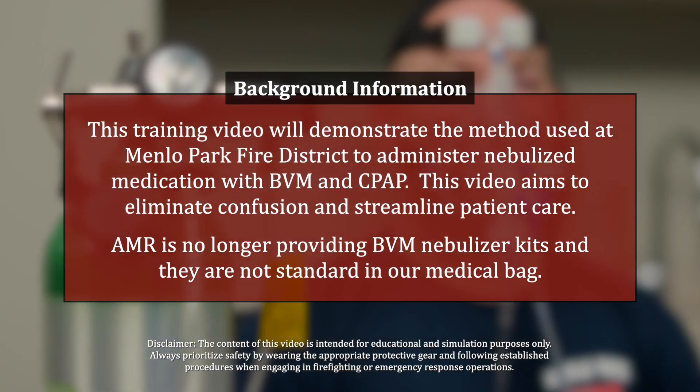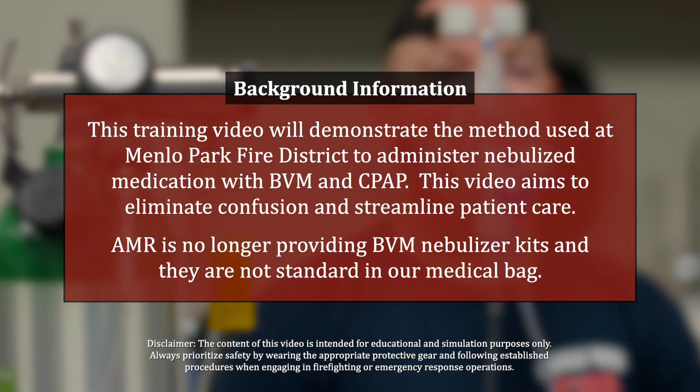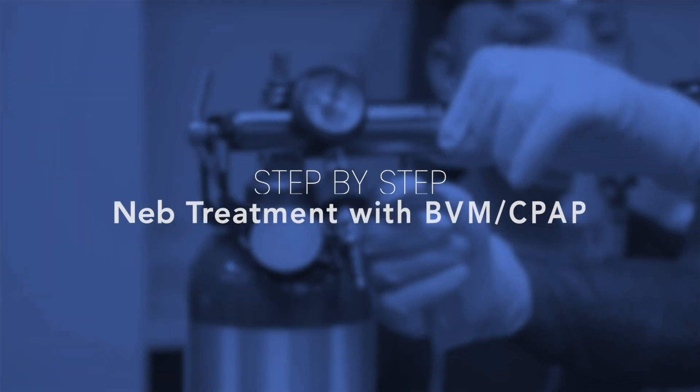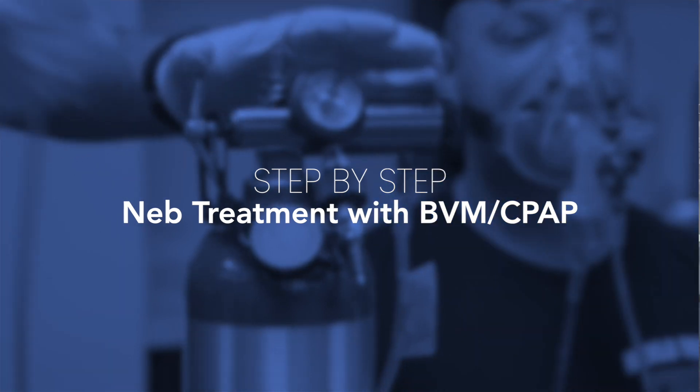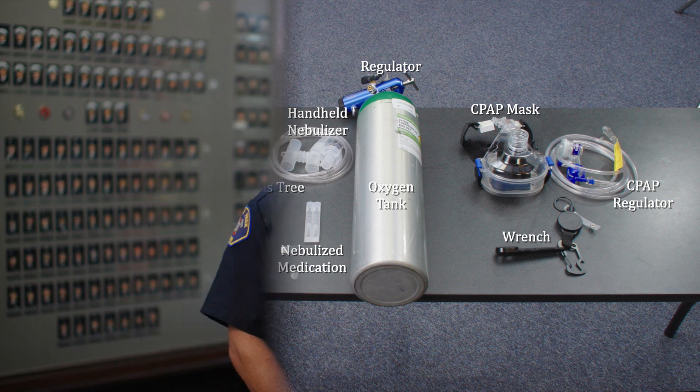AMR is no longer providing BVM nebulizer kits and they are not standard in our medical bag. We will utilize parts from the handheld nebulizer kit, the BVM or CPAP, and the multi adapter, which can be found in one of the inside pockets in the main compartment of the new EMS bag.